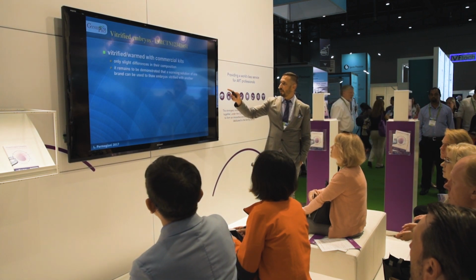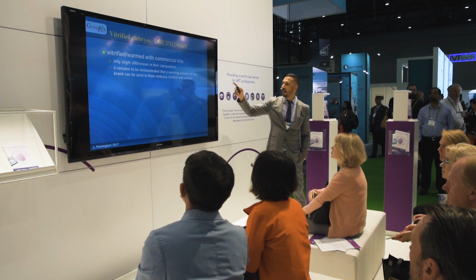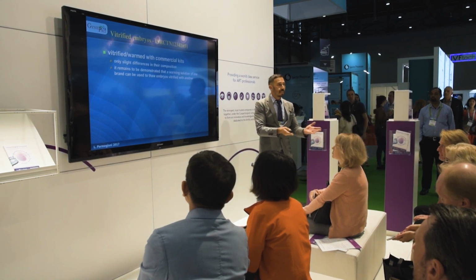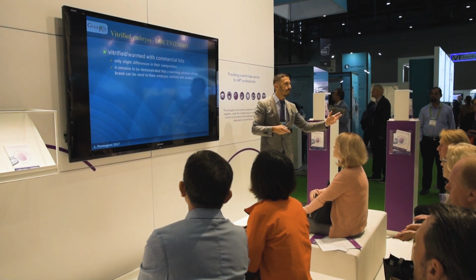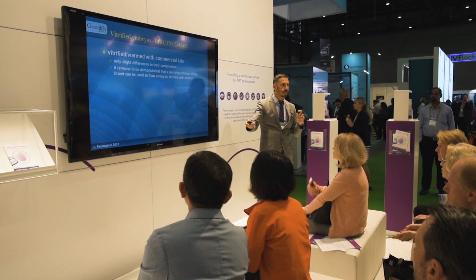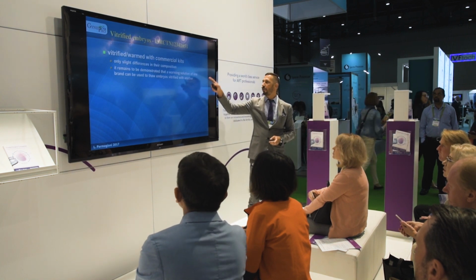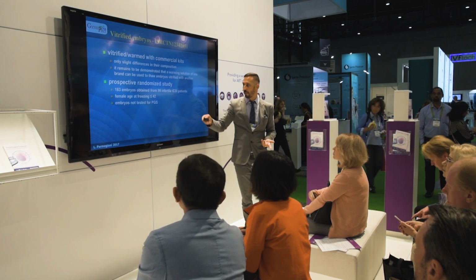So this is the first time that we present this data. Embryos can be vitrified and warmed with commercial kits. There are only slight differences in their composition. If you talk with some colleagues, they say, okay, I've used the Kitazato media to thaw these embryos that were vitrified with SAGE, but it remains to be demonstrated that a warming solution of one brand can be used to thaw embryos vitrified with another brand.